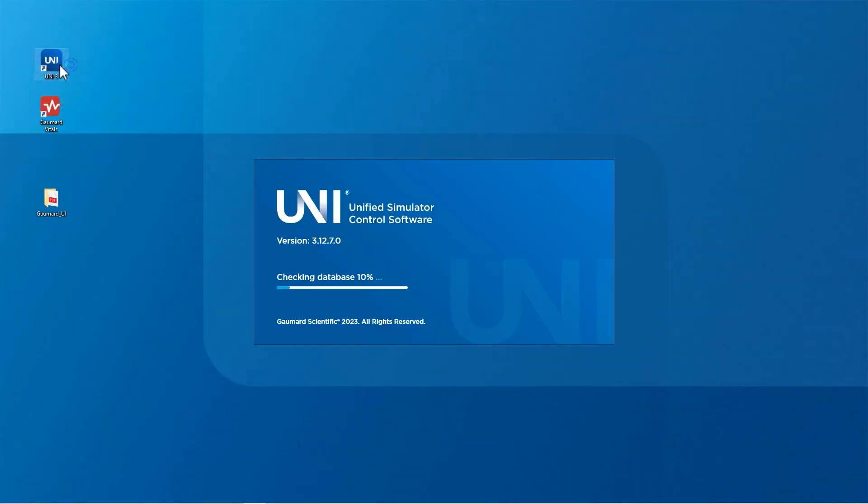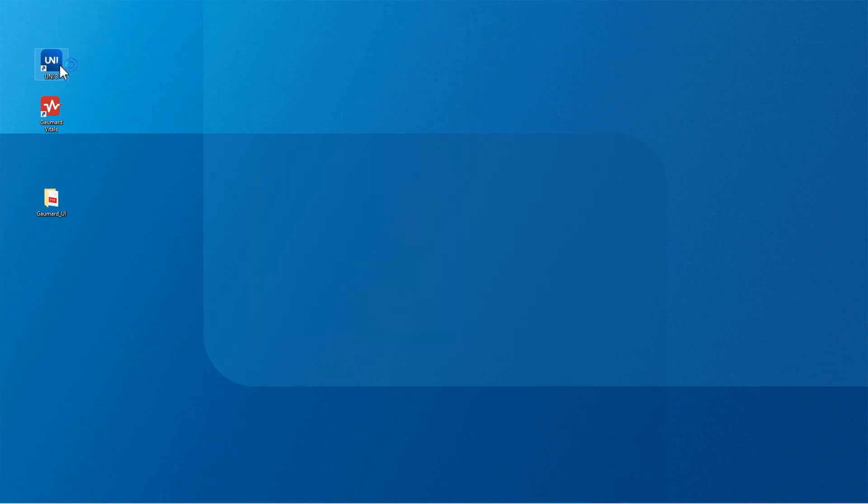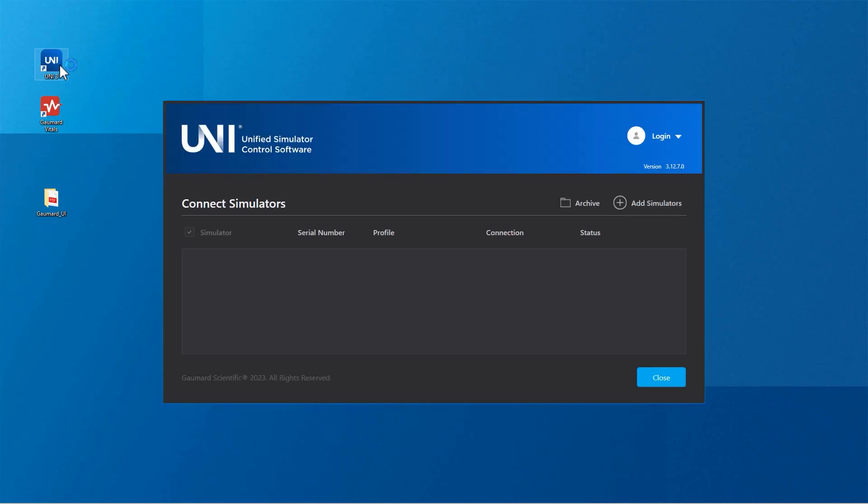To start, open the Uni3 software and on the simulator selection page, click Add Simulator. If your patient simulators are already listed in the simulator selection menu, skip ahead for connection instructions.